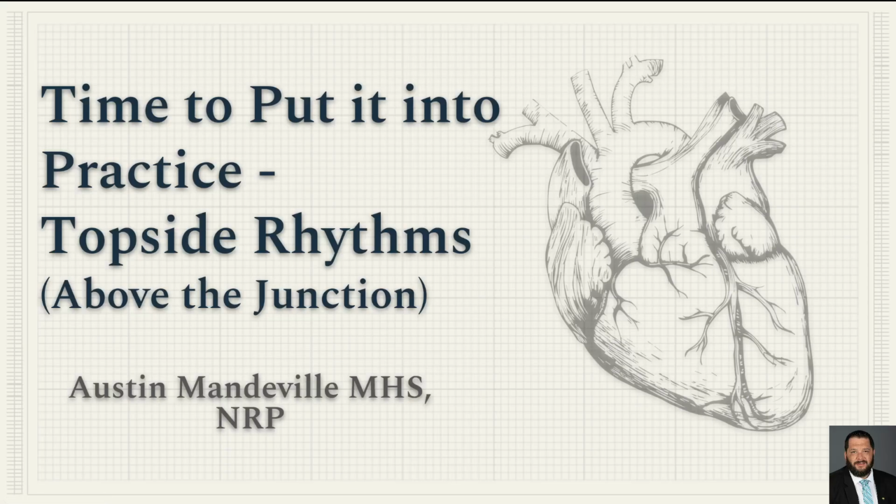Welcome back, everyone. To continue on the cardiology and ECG series, we're finally at the point we can start putting some of this information into practice. Up until this point, we've used the anatomy of the heart, the electrophysiology functions, and how the ECG monitor measures and displays waveforms, and how those waveforms correspond to various electrical actions within the heart itself. So now we're going to look at actually putting this information into practice and how we use it to interpret ECGs.